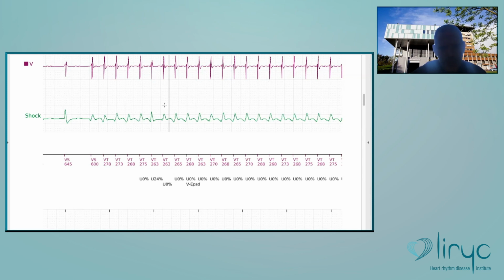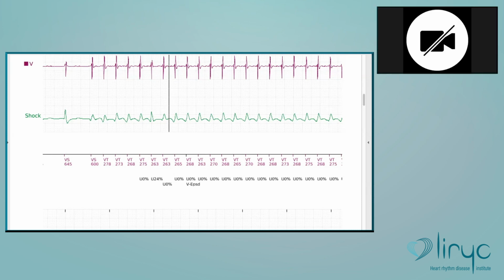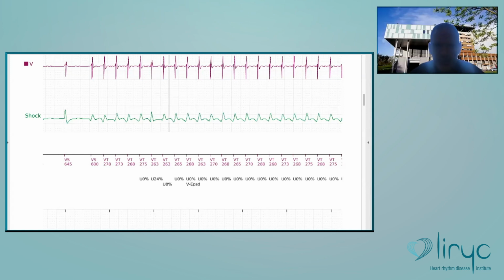Which company has a way to analyze the morphology very close to Boston? Which one? It's Abbott. Yes, Abbott is very similar. It also uses a threshold, and also both of the signals for the alignment.